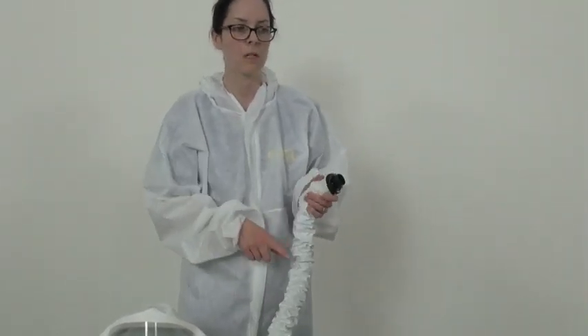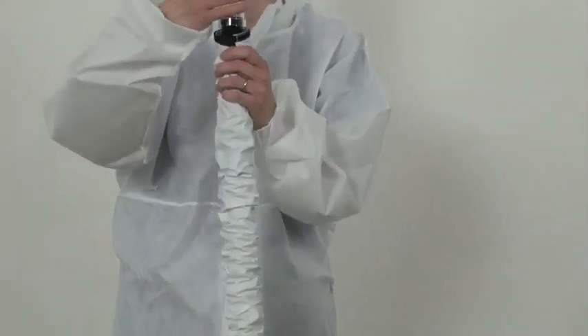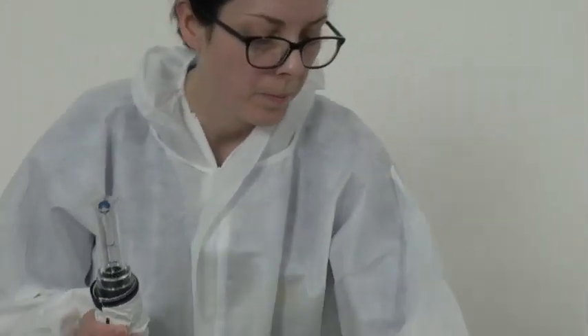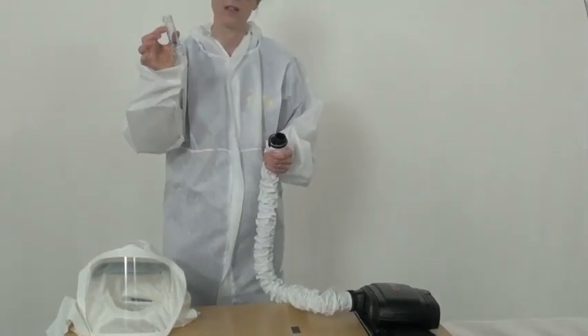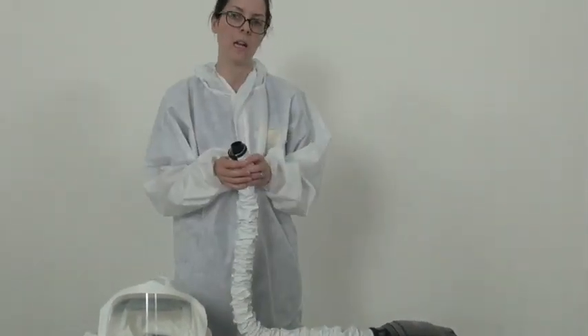With the pump still operating in low flow, connect the flow meter in a vertical position and ensure the ball is above the indication line. Switch off pump and remove flow meter, returning to designated storage area or clinical equipment library.